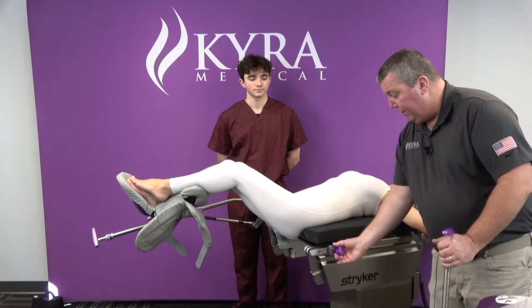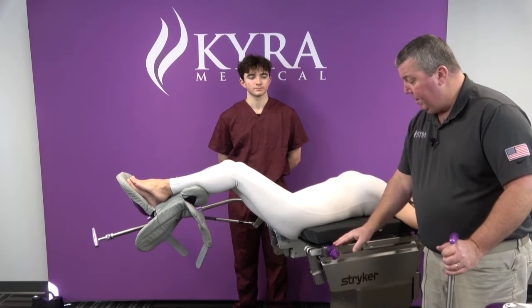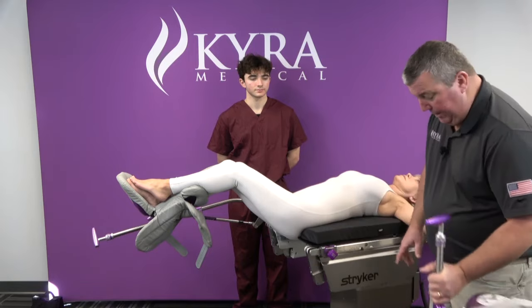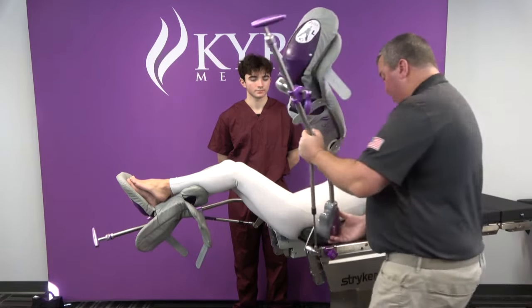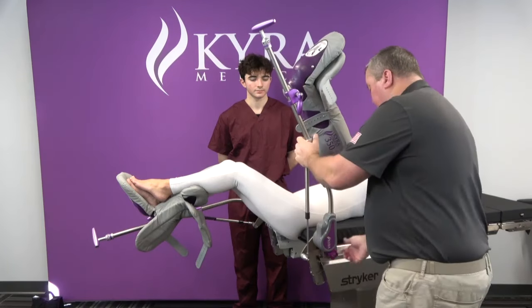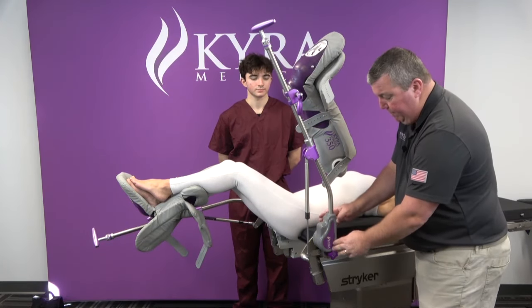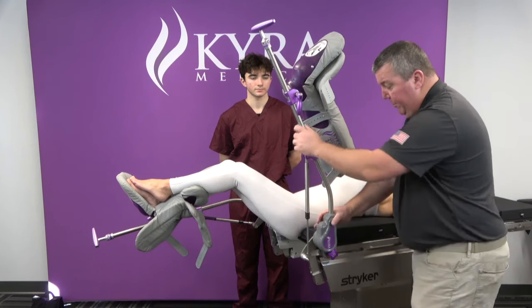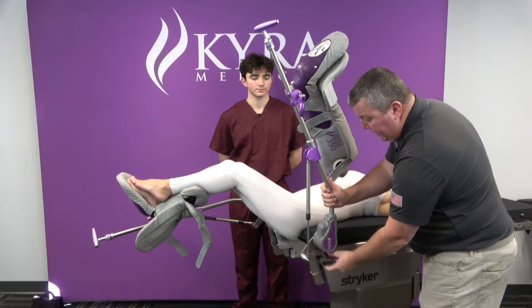What I want to do is put the clamp on. We have our secure release clamp. I line that up where the stirrup is going to be, and I want to know where that hip joint is, because when I put the stirrup in, I want the ball joint to be exactly where the patient's hip joint is. Once I'm comfortable with that, I can move this up and down as needed on the rail, then I'm going to tighten that down.